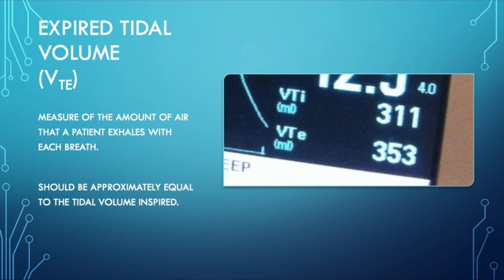Expired tidal volume is the measurement of the amount of air that a patient exhales with each breath. This is an important parameter to keep an eye on to ensure that the patient is not breath stacking or retaining air in their lungs.